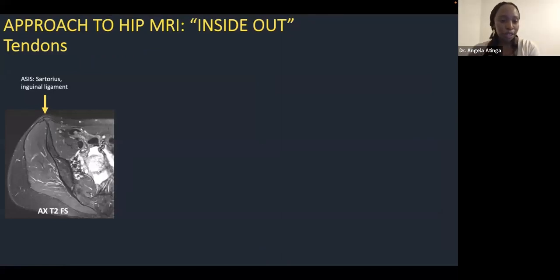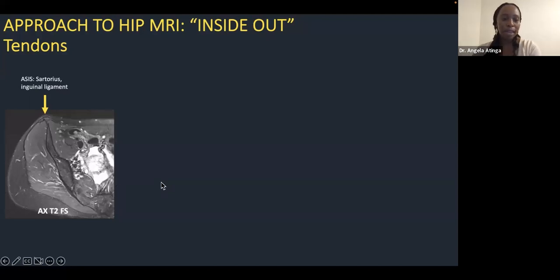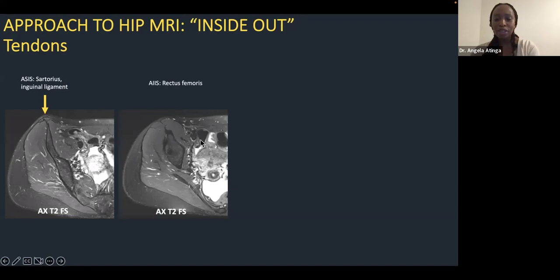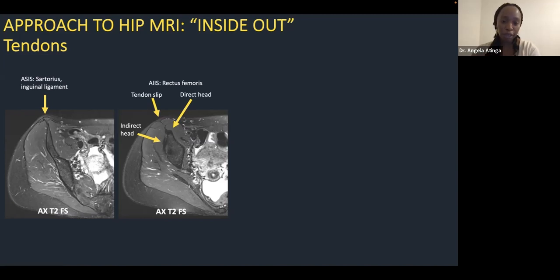Moving to tendons around the hip — a quick review on axial images. At the anterior superior iliac spine you have attachment of the sartorius muscle and inguinal ligament. Next slice down at the anterior inferior iliac spine — essentially the acetabular roof — is where your rectus femoris originates. It has a direct head coming off directly anteriorly, and an indirect head coming off the lateral margin of the acetabular roof. These come together to form a tendon slip: the indirect head forms the central component, and the direct head forms the superficial component inseparable from the overlying myofascia.